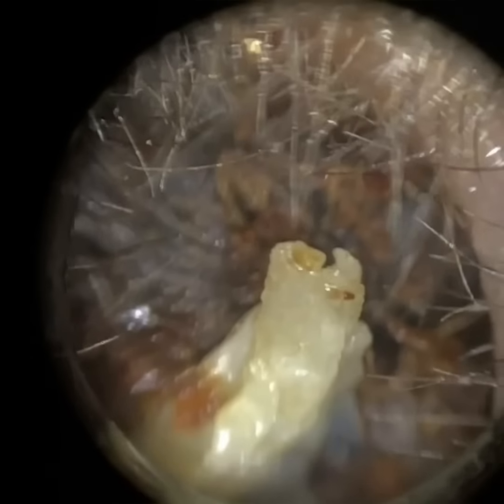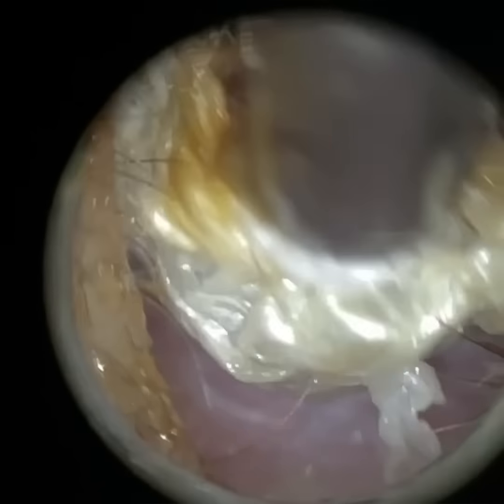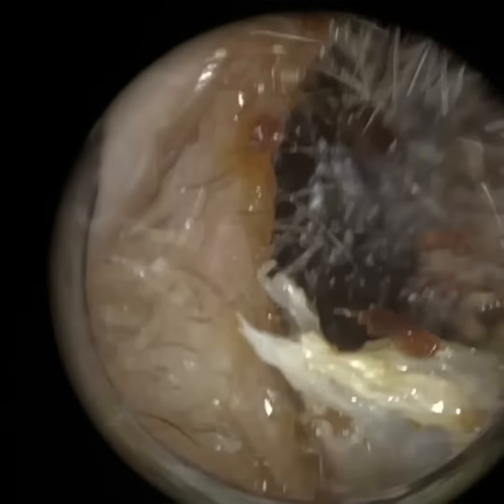So I've got the more lateral plug of dead skin out. You can see this white peripheral matrix. And once again, this is where the ear canal is widened. So with Keratosis obturans, especially with the type grade 2, 3 and 4, you get a global widening of the ear canal. And the way that works is, the inner 2/3 of the ear canal is made up of bone. And when you've got a dead skin plug like this, it compresses against the bony part of the ear canal. And that shear pressure itself, think about this like a rubber ball, just gets bigger and bigger.